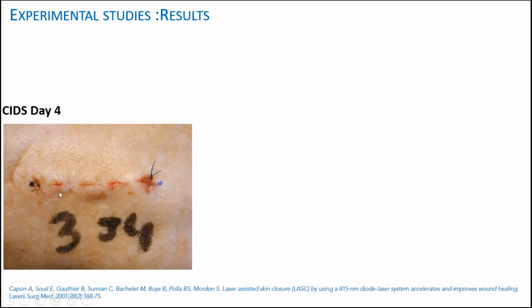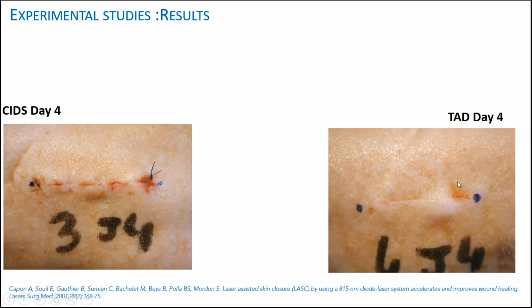We have inflammation, and we have the suture inside. Usually the suture was inserted inside the skin that way, and you can see on each extremity of the incision, 4 centimeters, the suture. This suture is usually removed after a few days, or we have also what we call resorbable suture that disappears by itself. That's the result without the suture, just with transparent dressing.